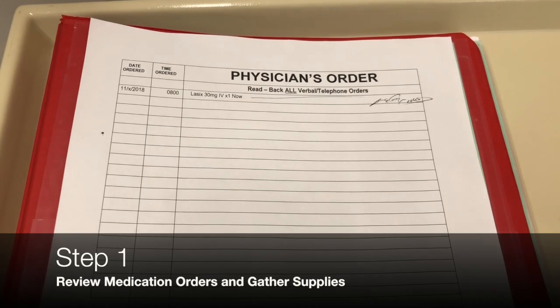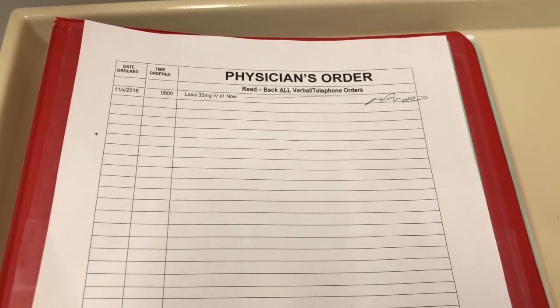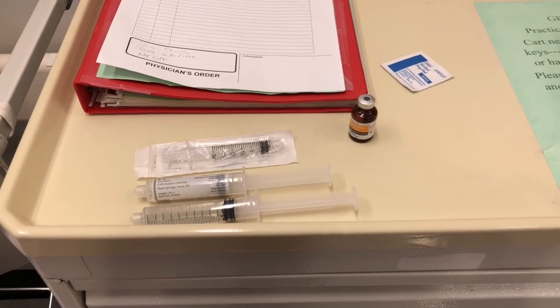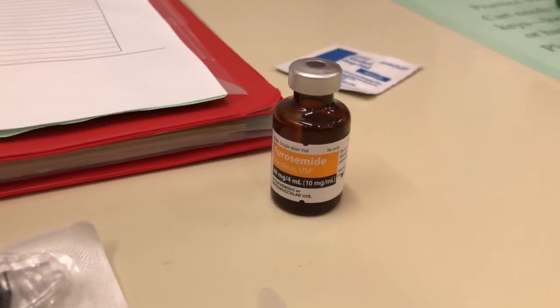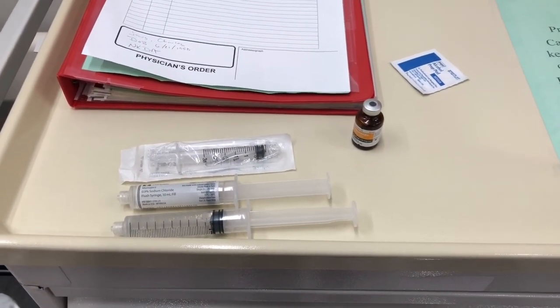The physician's order shows that the patient will be receiving Lasix 30 milligrams IV now. The patient has a central line and the medication will be going through that. Before I go to the patient, I will grab the medication, which is shown as 40 milligrams per 4 milliliters. I'll grab my alcohol swab, 2 saline flushes, and a 3 milliliter syringe.